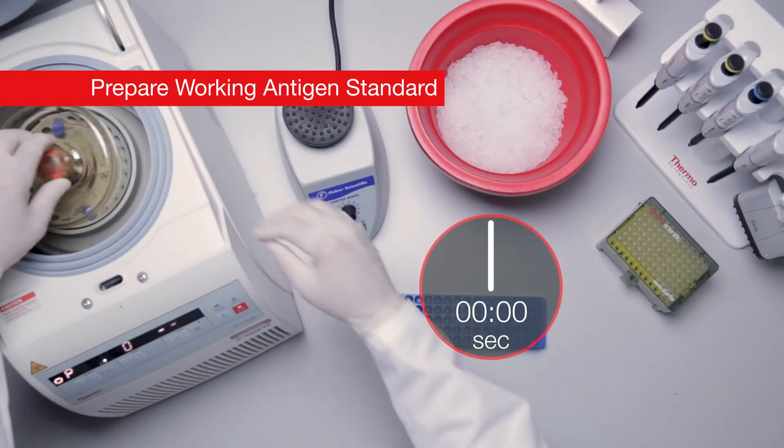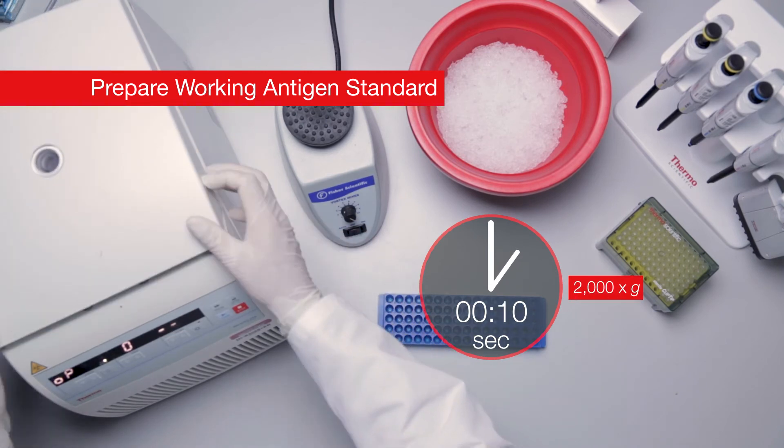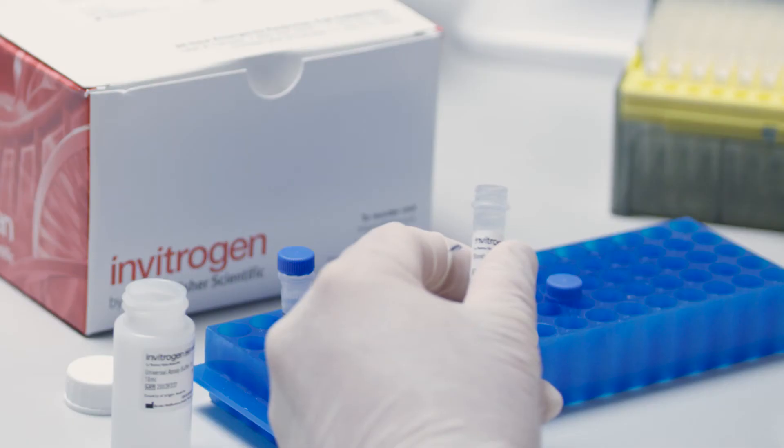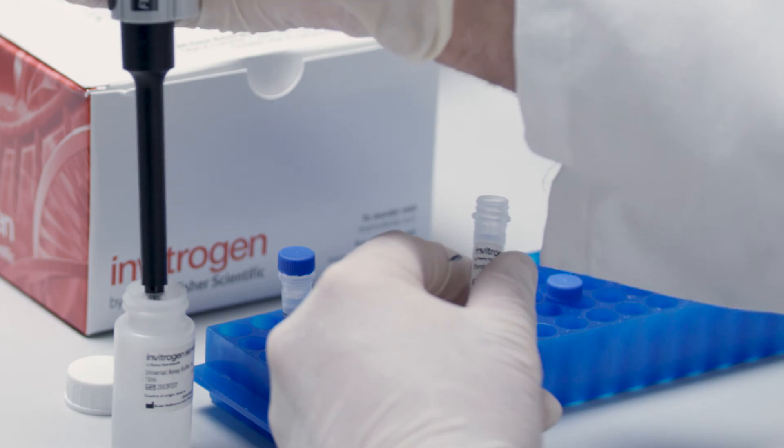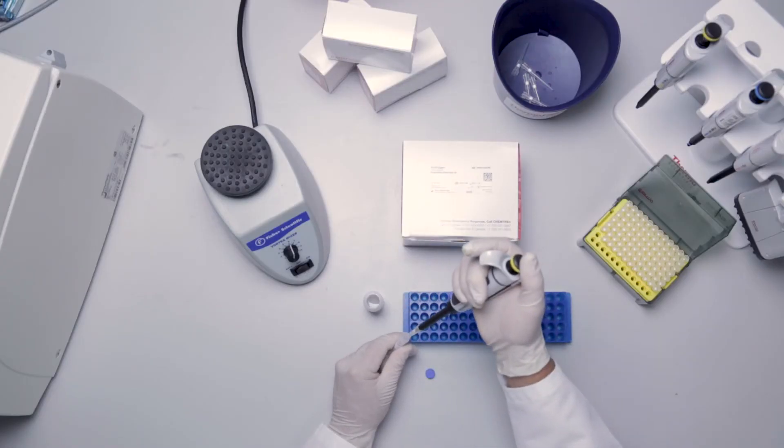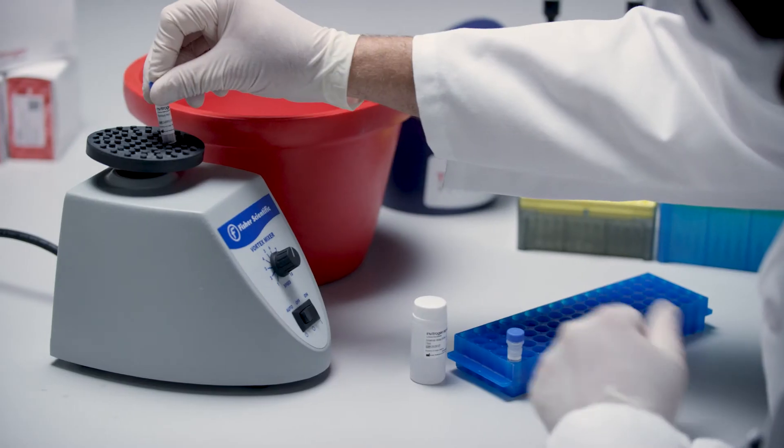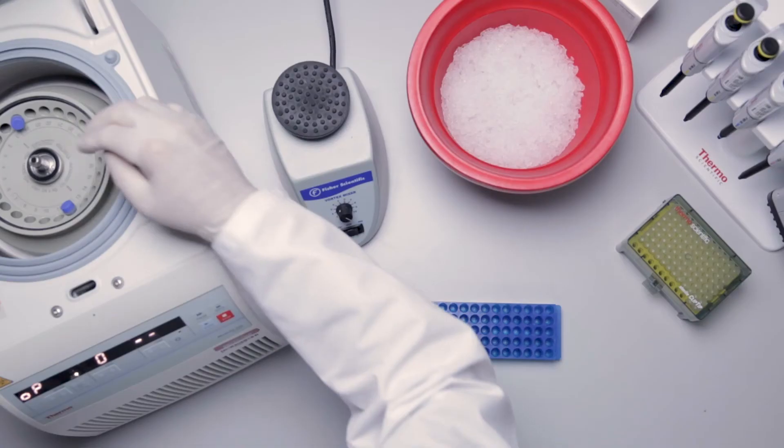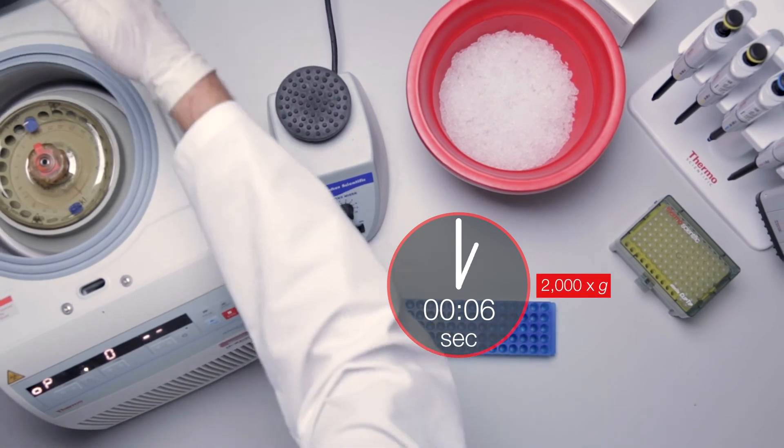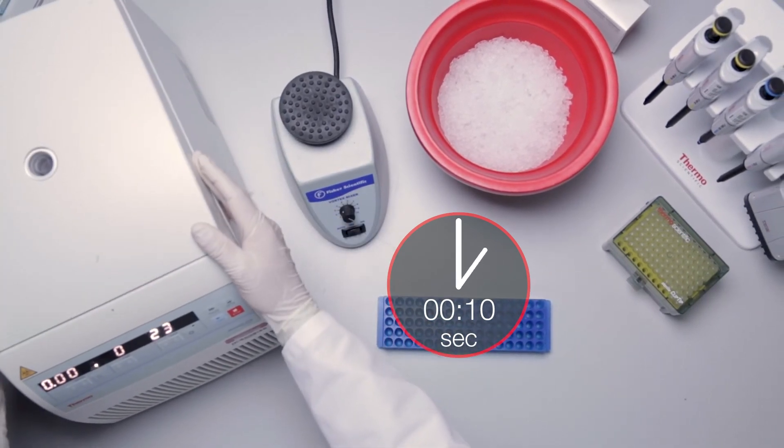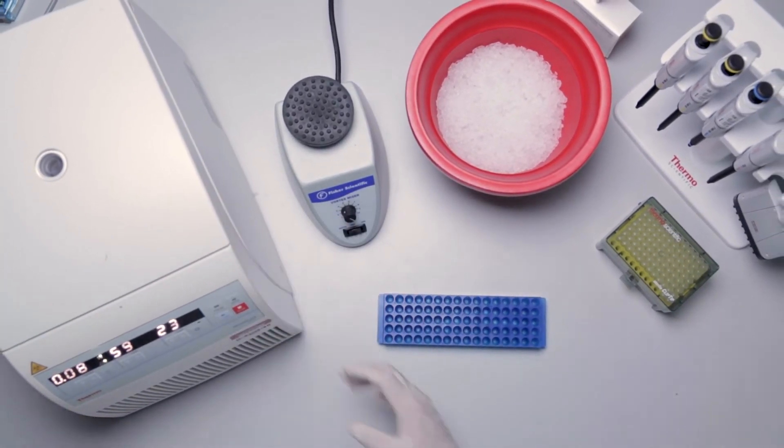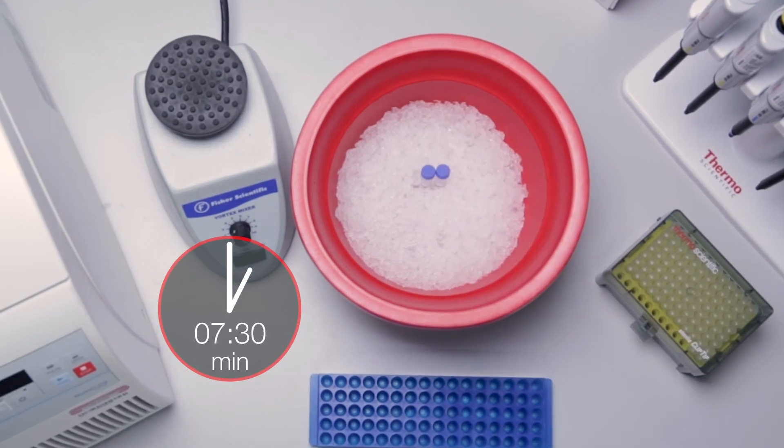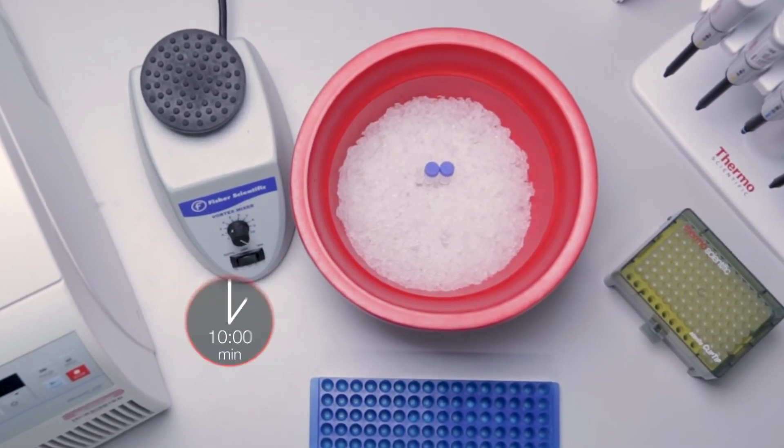Centrifuge each different standard vial at 2000 g for 10 seconds. Add 50 microliters of universal assay buffer or cell culture medium to each vial. Vortex each antigen standard vial at high speed for 30 seconds. Centrifuge at 2000 g for 10 seconds to collect the contents at the bottom of the vials. Incubate on ice for 10 minutes to ensure complete reconstitution.